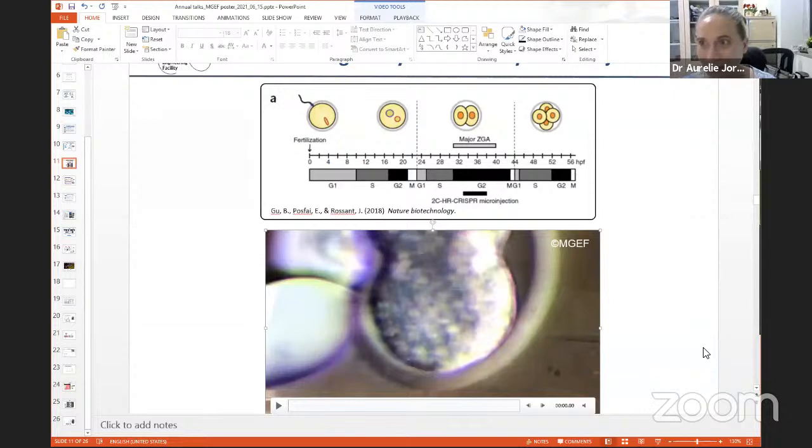It's amazing how these embryos take all of this very violent physical stress, but they do well. If they are going to be damaged by the physical stress of the microinjection, the lysis happens almost immediately. Within 2 minutes, your embryo just collapses. So usually we wait a few minutes or an hour and we see that the embryos are fine. We segregate the ones that have been damaged or lysed by the injection, and we only take the healthy embryos for embryo transfer.